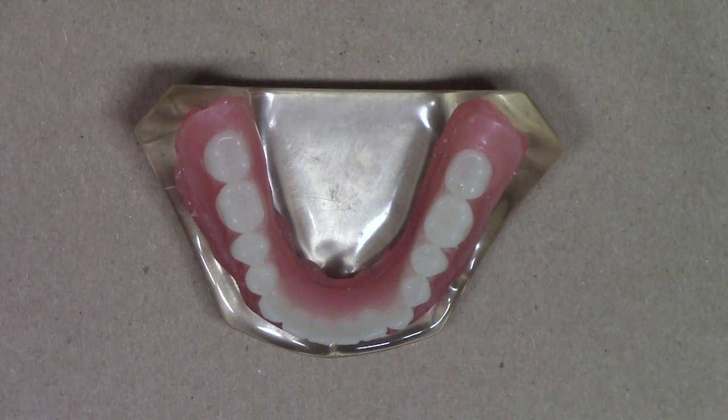Now, of course, with our patients, we have to be careful with any sort of denture home care. It's important to make sure that we just encourage our patients not to put this in with any aggressive denture cleaning fizzy tablets, but just to rinse this with a sponge or gauze under running water. And of course, they can use some light materials to clean the denture with, but I really recommend just water.